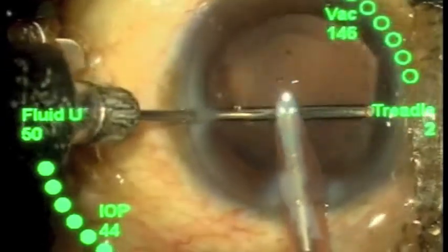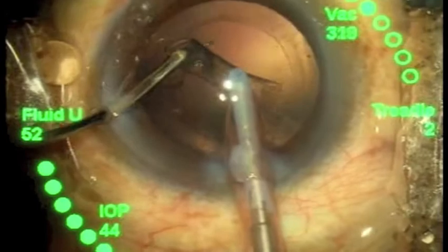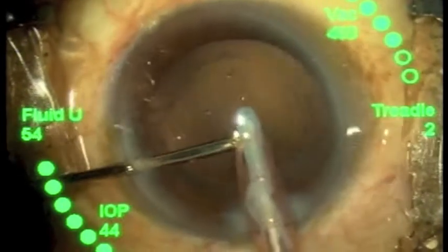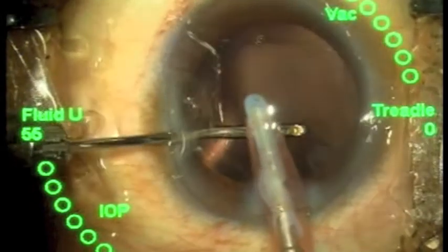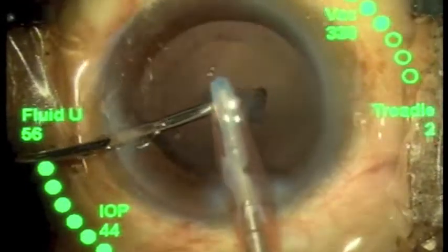With this setup for coaxial bimanual I&A, it is a low-cost system which does not require any purchase of specific bimanual handpieces. There is no need to create additional paracentesis, and all the features of bimanual I&A are retained.